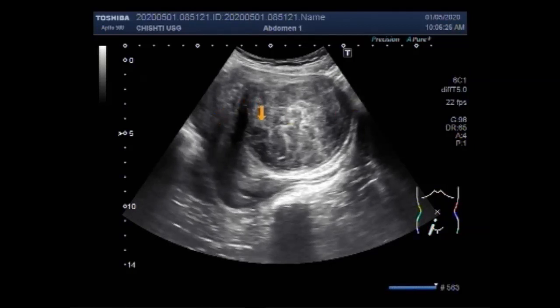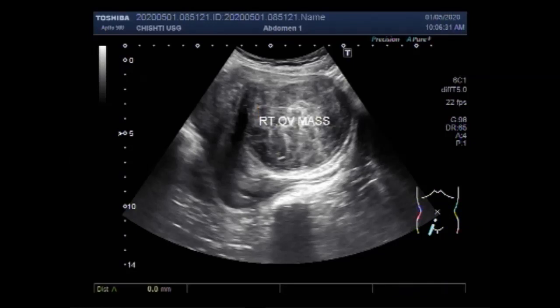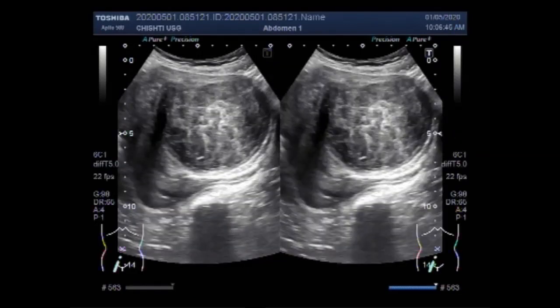Symptoms of ovarian cancer may include abdominal pain or bloating, constipation, increased urination, back pain, fatigue, heartburn, and feeling full quickly. You can see the size of the mass — it measures about 7.8 centimeters.